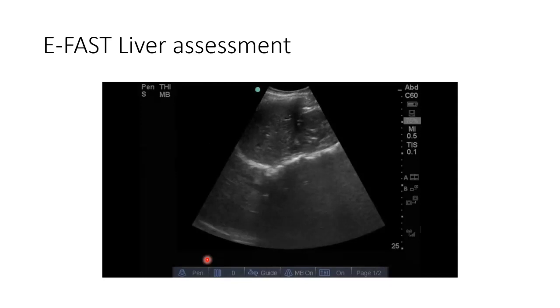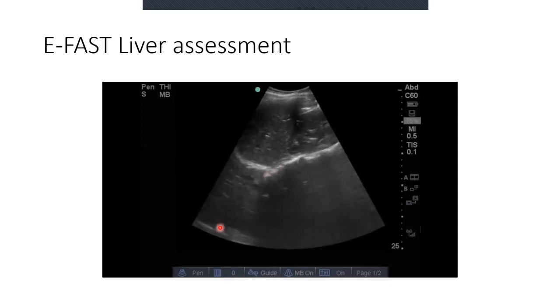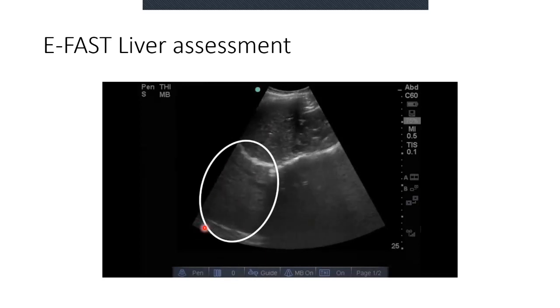And you can see this because the spinal stripe stops at the diaphragm, and as we all know, the spine does continue past the diaphragm, but what we see above the diaphragm is the absence of the spinal stripe and the presence of what appears to be liver. If you look closely, the liver matches on both sides of the diaphragm with hepatic vessels noted on both sides. You can see the spinal stripe stops right at the diaphragm, and we see this area mirroring there, showing what looks like liver above the diaphragm. This tells me that there is aerated lung opposed to the diaphragm, or normal interface.